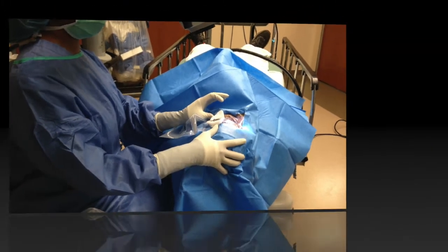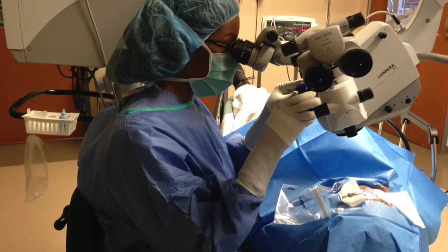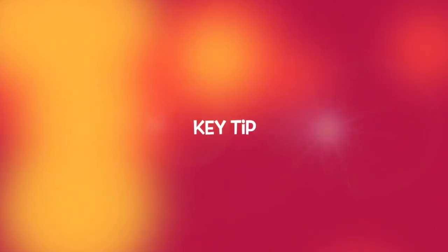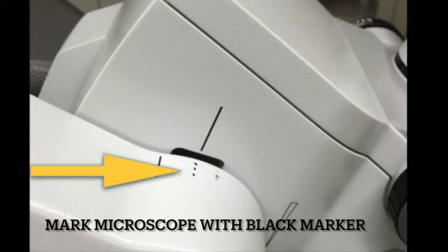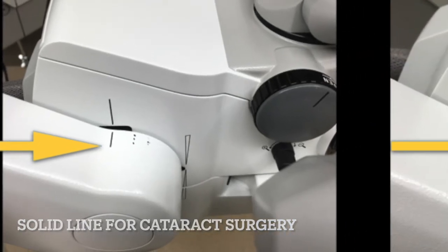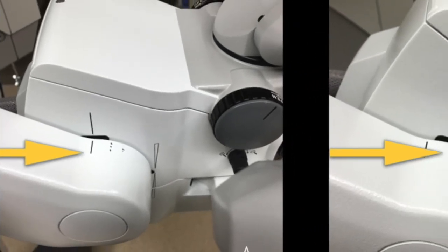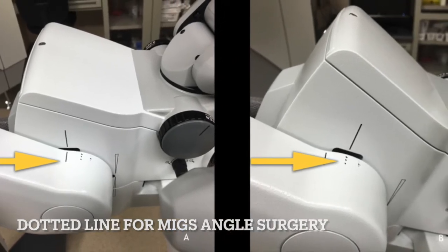The next key step is to tilt the microscope towards you in order to achieve finer visualization. This should be about a 30 to 45 degree angle towards you. What I have also found very important is that once I have established a nice angle for my routine MIGS surgery, I mark the microscope with a black marker. This allows me to easily find the angle as I am often going from a position where the microscope is straight for cataract surgery to tilted for the MIGS part of the procedure.